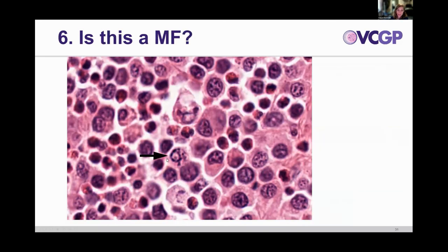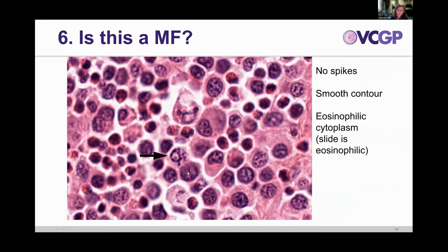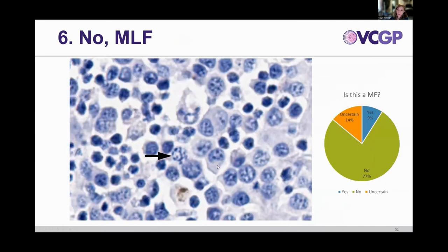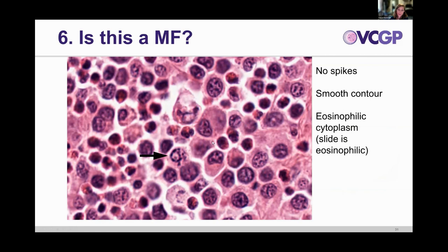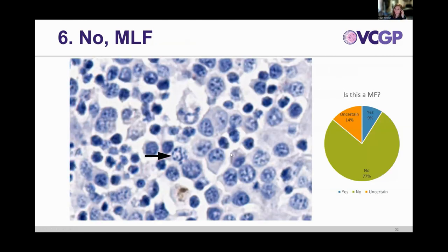Number six: we have a ring-shaped hyperchromatic structure. The key feature is that it's pretty smooth. You can't really use eosinophilic cytoplasm because the whole slide is eosinophilic, so the smooth contour is what's helpful here. Looking at the PHH3, we have a negative result, and most people agreed with that. We also have a very similar structure elsewhere in the image that also doesn't stain with PHH3 — that's a mitotic-like figure.